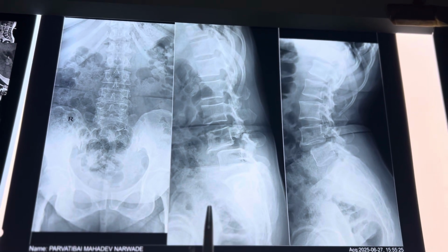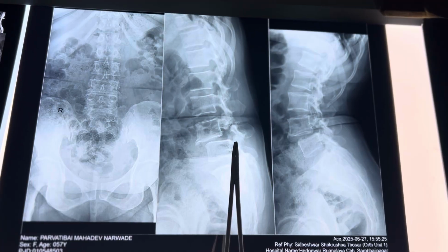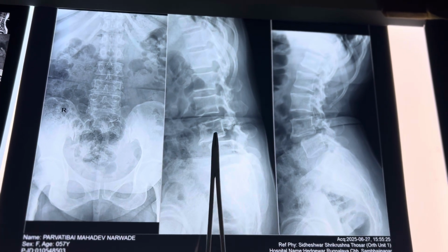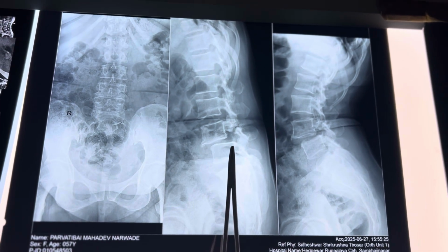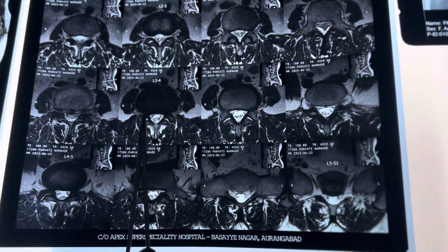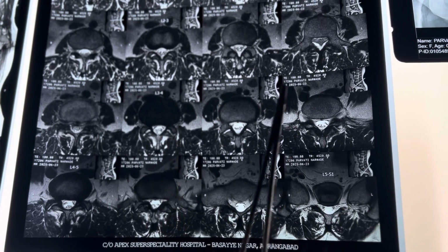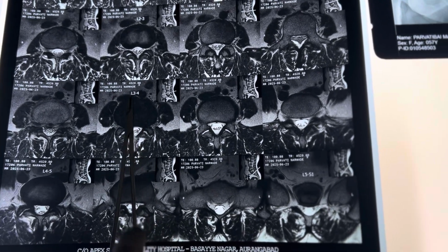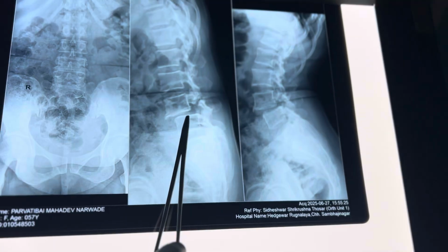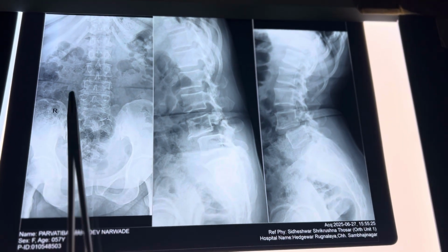This is a case of a 57-year-old female with an L4-5 lytic listhesis, an L4 lysis, and a grade 1 to grade 2 listhesis. She has bilateral lateral recess stenosis at L4-5. There is a sacralized L5, which is why they have labeled it as L3-4, but this is the second last mobile level where we are going to do the transforaminal lumbar interbody fusion.